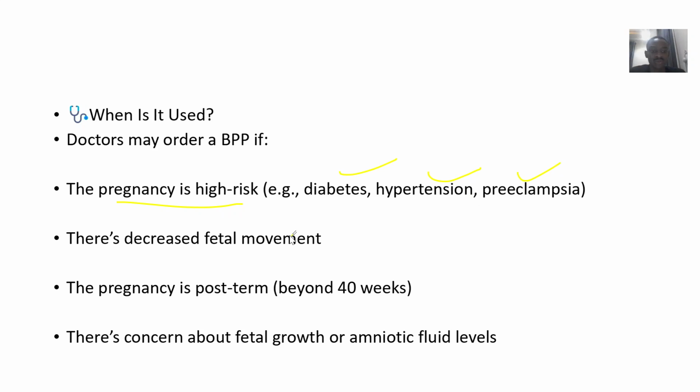All right. So the doctor will also order it if he notices that the baby is not moving much again. The doctor also orders it if the pregnancy has gone past when a mother is supposed to give birth. All right. So you also order it if there's a concern about fetal growth or amniotic fluid levels, if it is adequate or not.